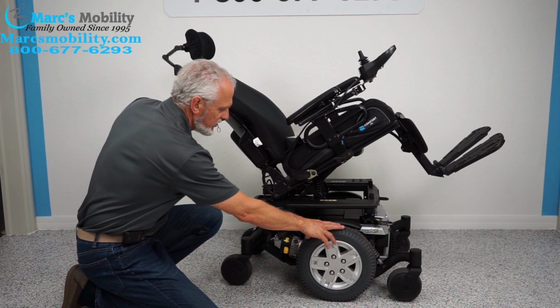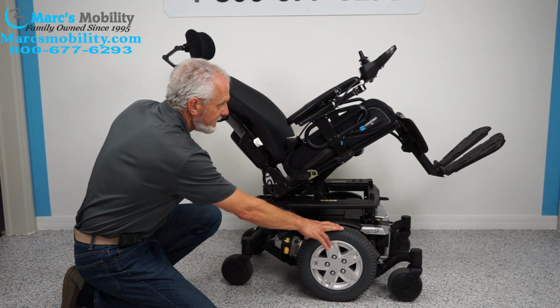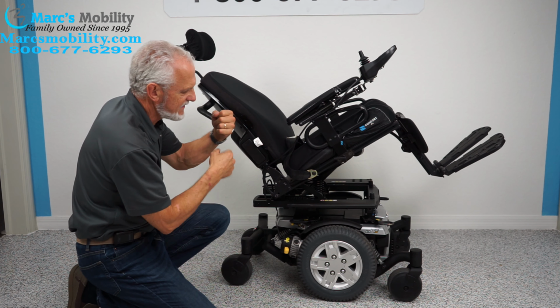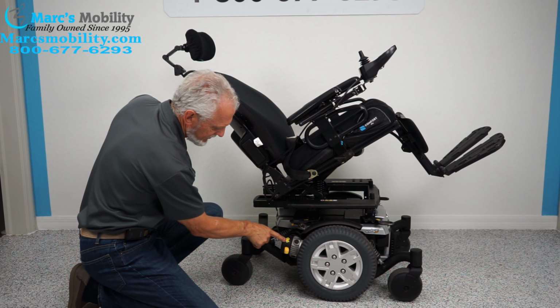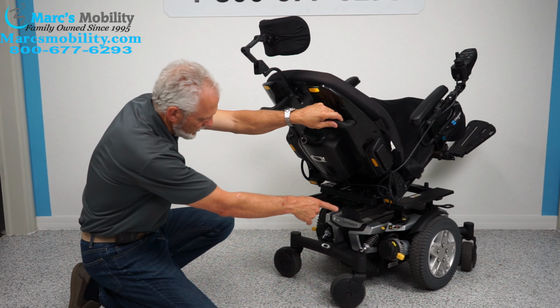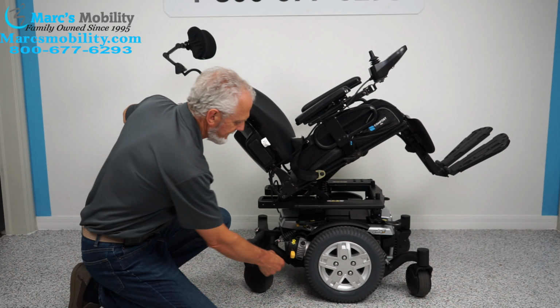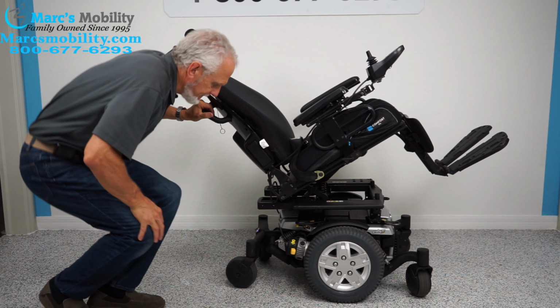So if you're gonna put the chair neutral, you wanna roll it, you can see it's not going anywhere. But if you turn the power off, and the reason you want the power off, you want no resistance in the motor. And as soon as the power is off, go to your yellow lever and it tells you right here. Push it down. What that does, it unlocks your wheel. You got to do both motors, and then you can roll it around. Okay? So we're back in gear, and then you turn your power back on.